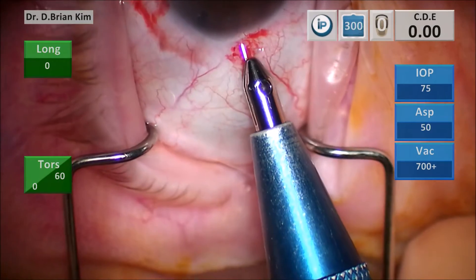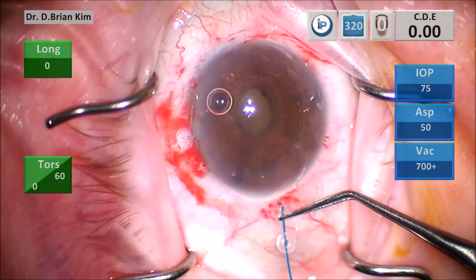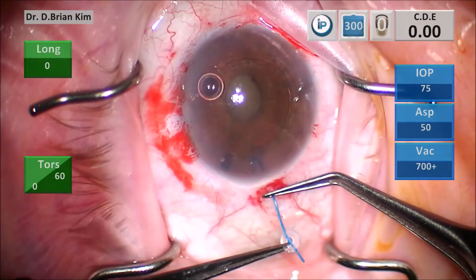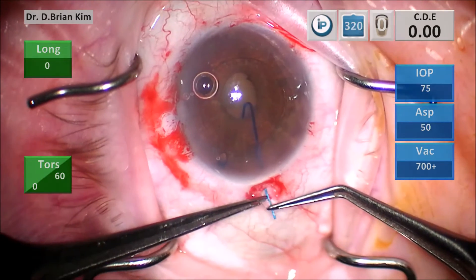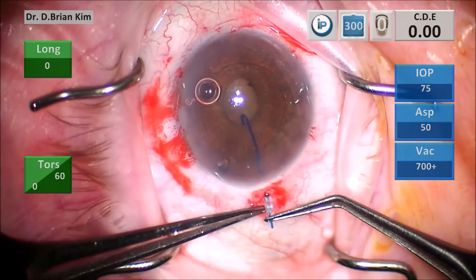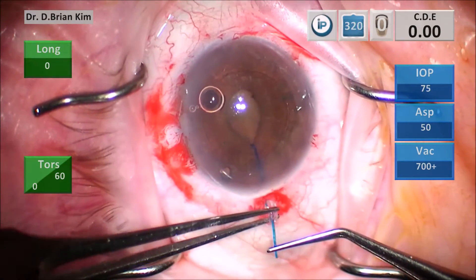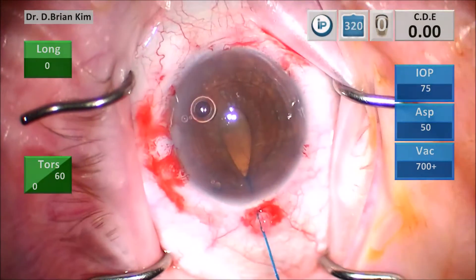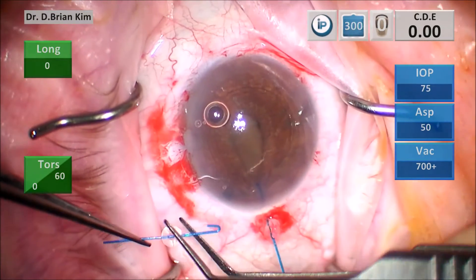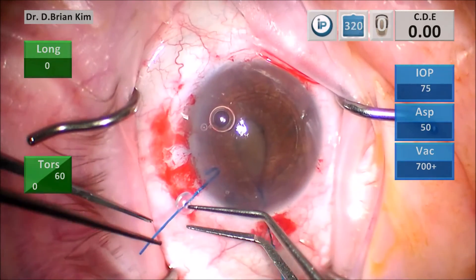After I make my main keratome incision, I make a small scleral incision underneath the main incision and place an iris hook. You want to do this because in cases of small pupils and potential zonulopathy you can get iris prolapse, so you want to be able to put traction on that pupil so that it doesn't tend to go out of the incision.